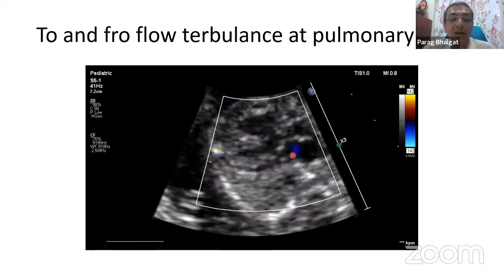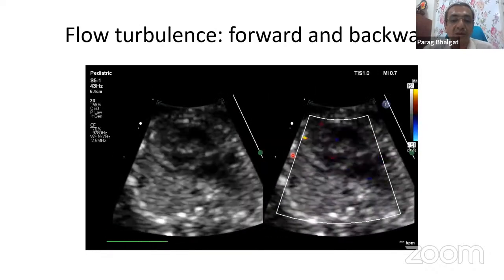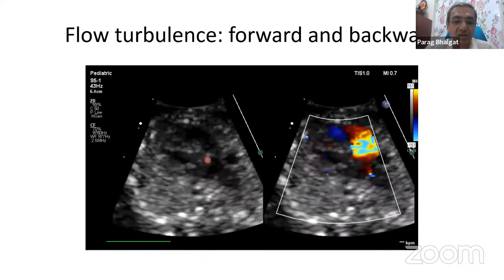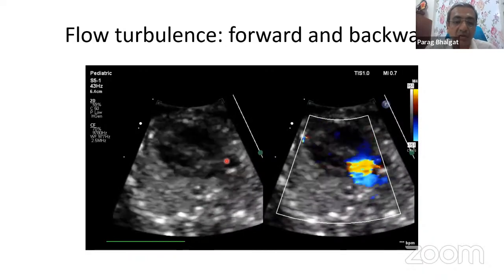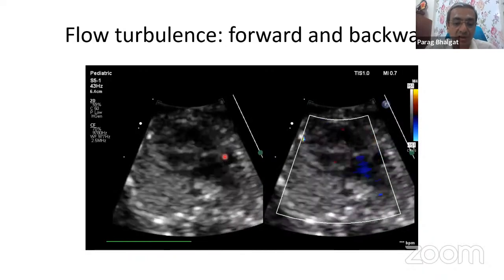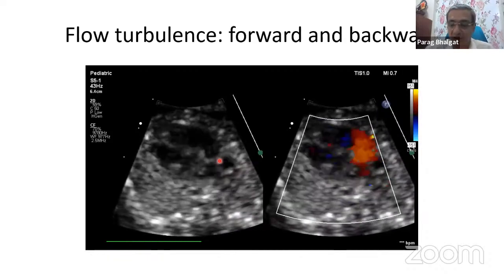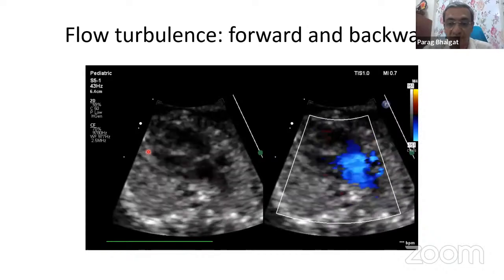This is with a cardiac C5, S5 probe, not C5 probe. With another, now this is the annular stenosis and pulmonary valve, dilated PA branches. They are bigger than the aorta. See, this is the aortic annulus, ascending aorta. Compare them with the size of RPA and LPA. RPA, LPA are bigger than the ascending aorta. A very unique feature of this condition.